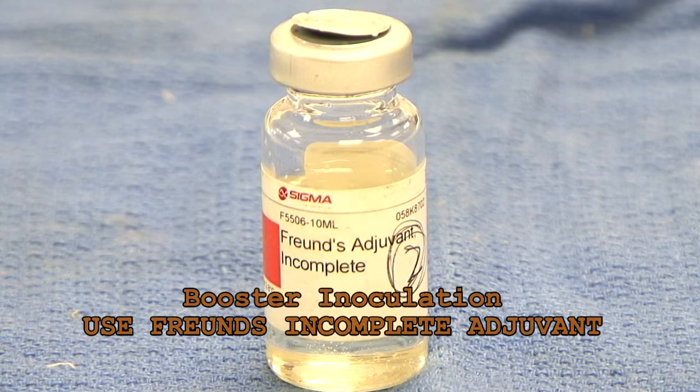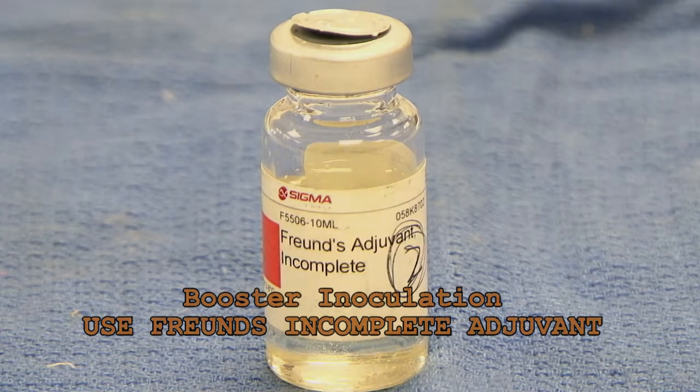If you were preparing a booster inoculation, you would use instead Freund's incomplete adjuvant.